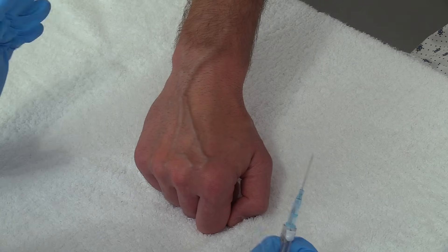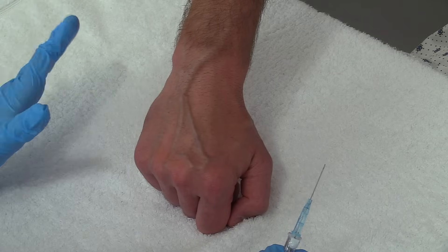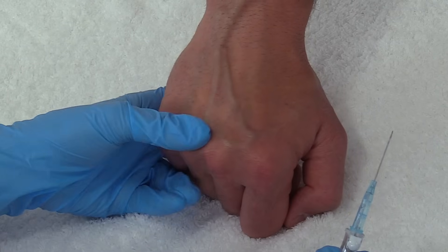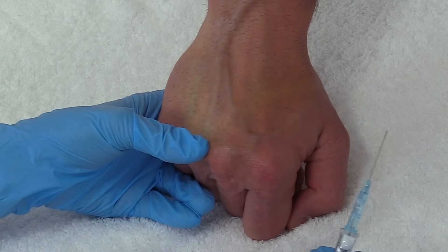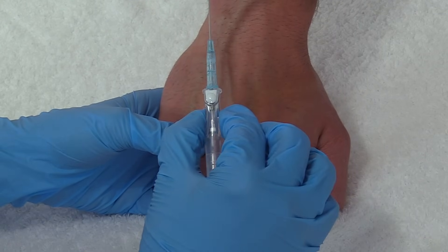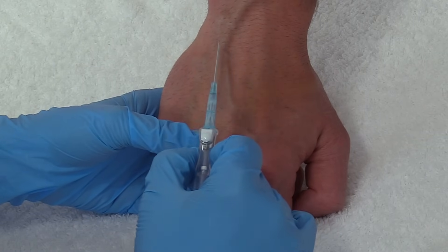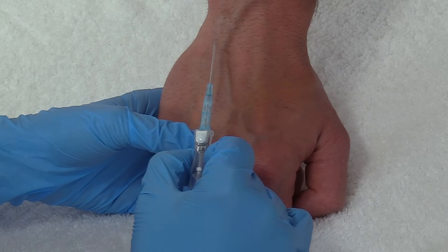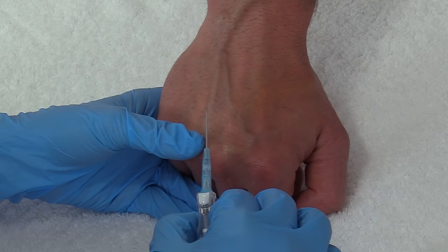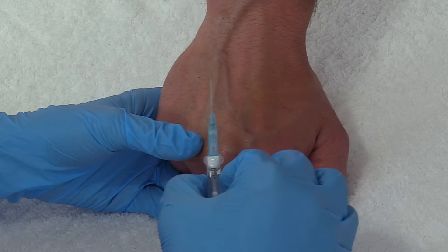Now the site has completely dried so I'm ready to stick the vein. First I want to stabilize this vein — I don't want it to roll away on me. So I'm going to go below the area where I cleaned and just pull on the skin which will help stabilize the vein. Then I'm going to hold my IV with my thumb and index finger, hold it bevel up, and go in at about a 20-degree angle in the direction the vein naturally runs, because we just want this plastic cannula to slide in there.